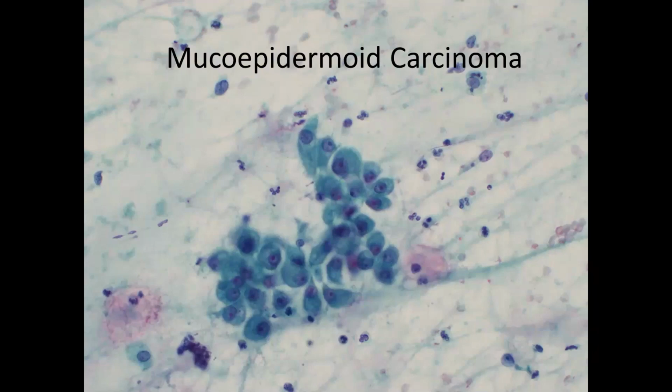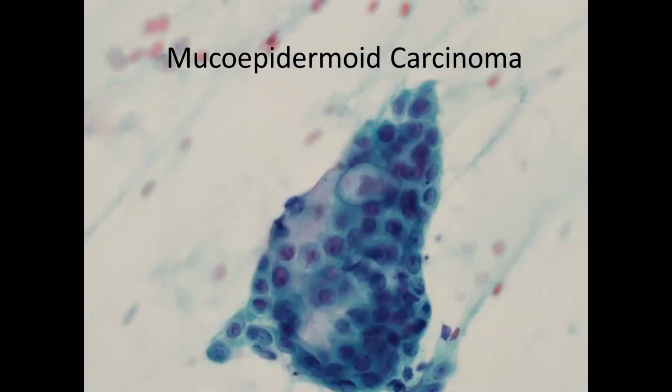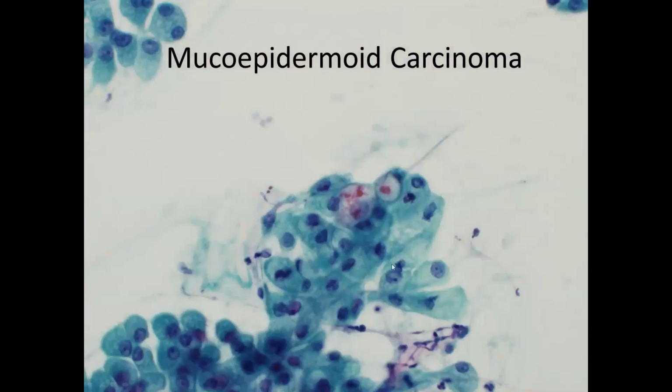So what I like to do is look for cells interposed into the groups of squamoid cells. When I see the histiocyte-like cells, the goblet cells, punctuating the groups of squamoid cells, that to me is the most convincing thing. When you see it like this, where the goblet cells are not floating around in the background, where it's difficult to tell them from histiocytes, but where you see them associated with the groups of epidermoid, squamoid cells, that to me is the most convincing. Again, you've got your nondescript squamoid cells, and then you've got punctuation by goblet cells containing mucin.